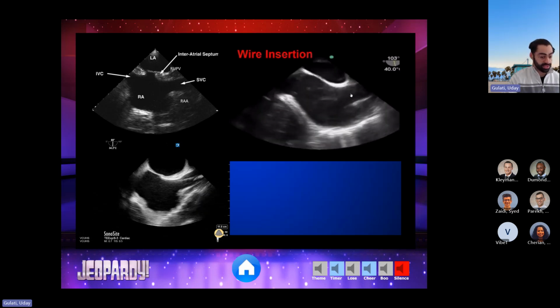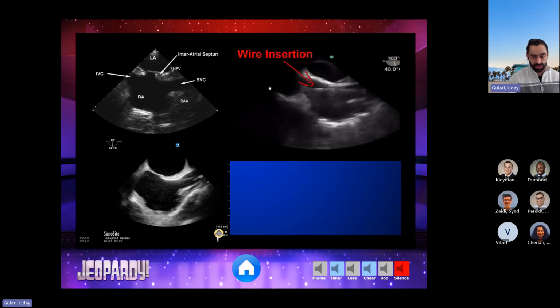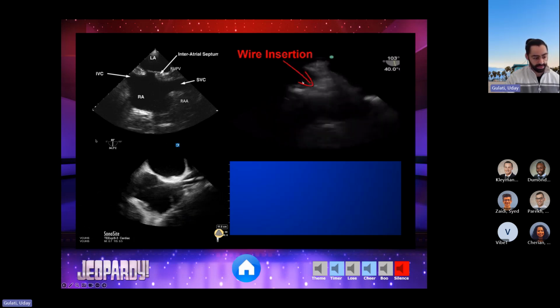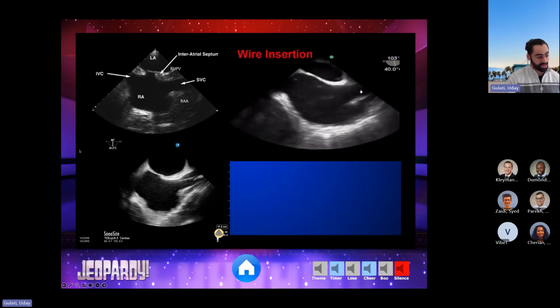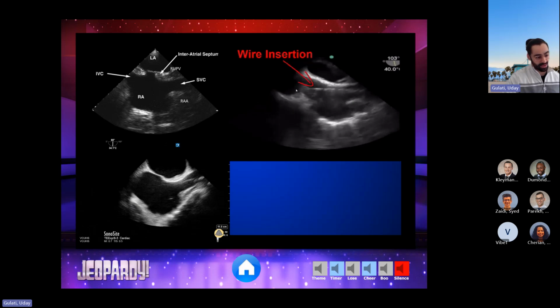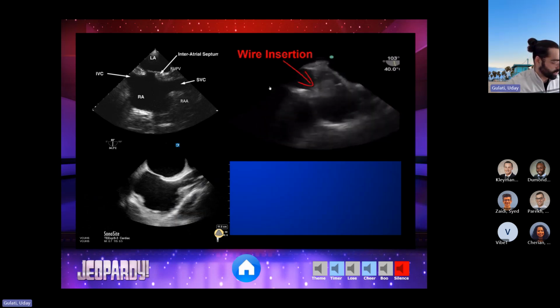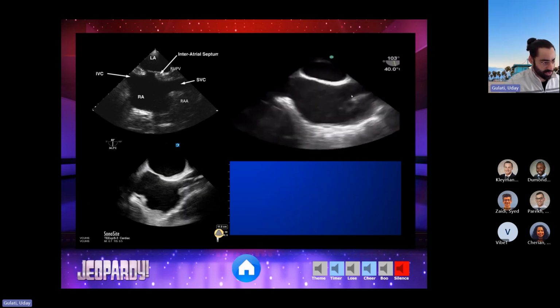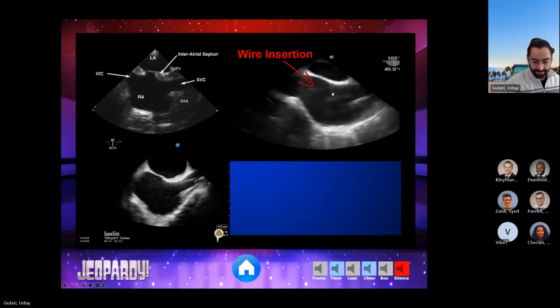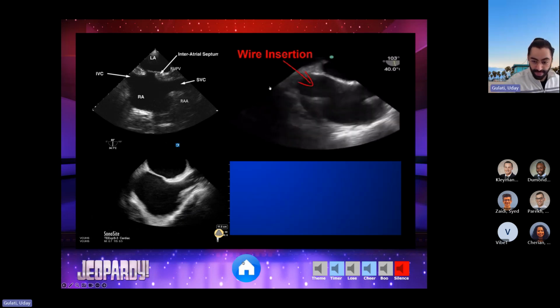Just like we would with a central line where you're scanning the neck, but here you actually want to see it because it's going much deeper in and it's a larger catheter. You want to be sure that you're correct. Now, there are people that will do this without using TEE at bedside to put these catheters in. And that's when you get malpositioned catheters, like you guys saw the one from early in the week. I hope everyone saw an X-ray. So when you guys are at your next spots and you're leading the ECMO programs there, highly advocate for TEE.